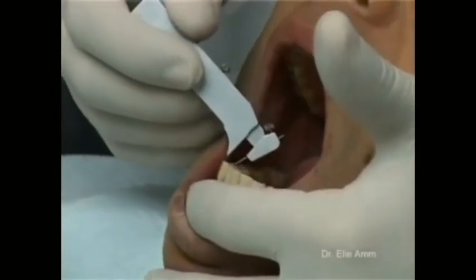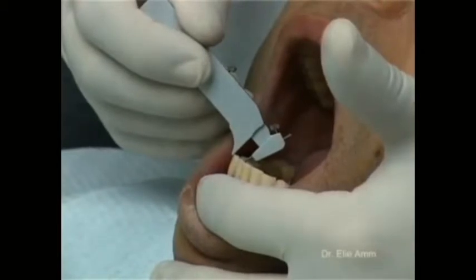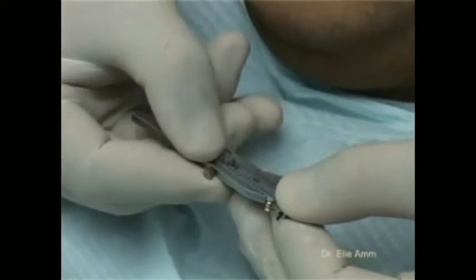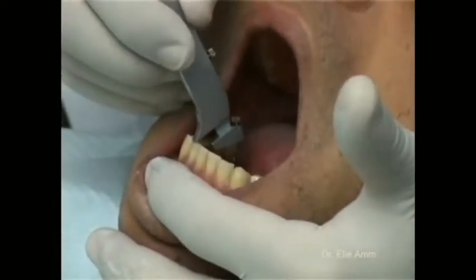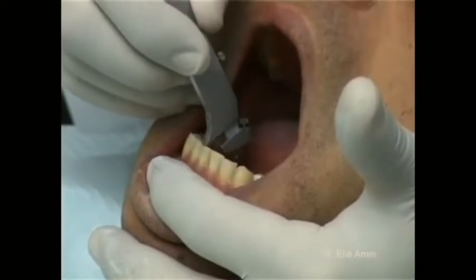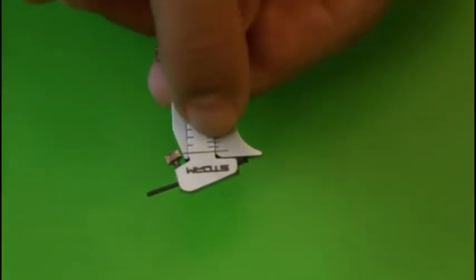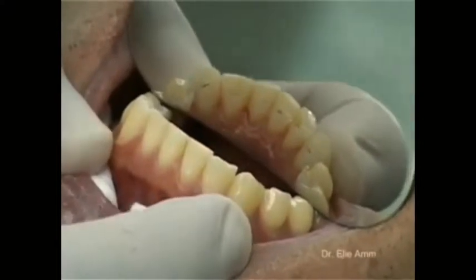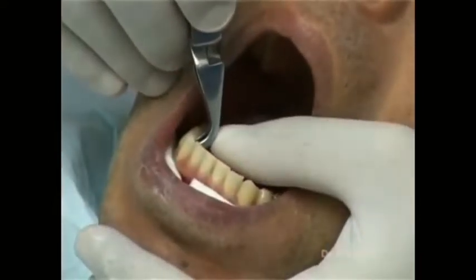The forested ent lingual calipers are a useful instrument for determining the exact bonding position of each individual bracket. The appropriate bonding height is marked on the conditioned enamel surface with the aid of the integrated graphite lead. During adjustment, ensure that the graphite tip contacts the slide bar when the sliding gauge is set to 0 mm. Then the composite coated brackets are bonded tooth by tooth, positioned optimally using the scaler, and the adhesive is light cured.